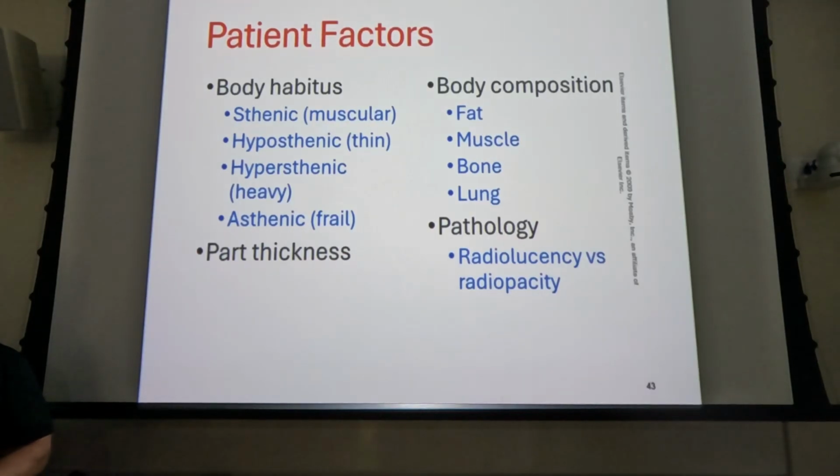All right, so let's say you got a patient with healthy lungs versus a patient with massive pleural effusion. Additive, subtractive? Is the pleural effusion going to absorb more x-rays? Yeah, so it's additive, right? As opposed to a pneumothorax. Now the lung is collapsed and all you've got is air and you don't have any of those lung markings at all.